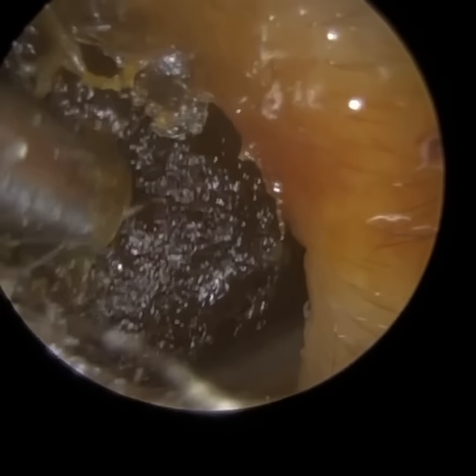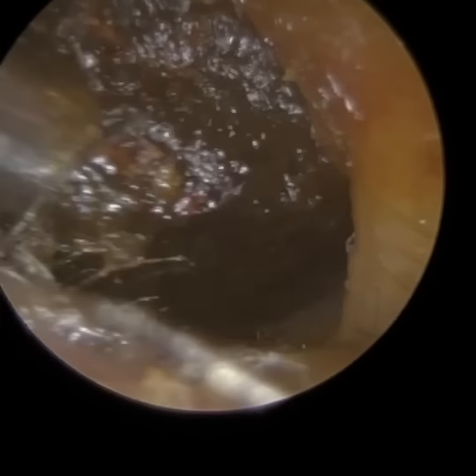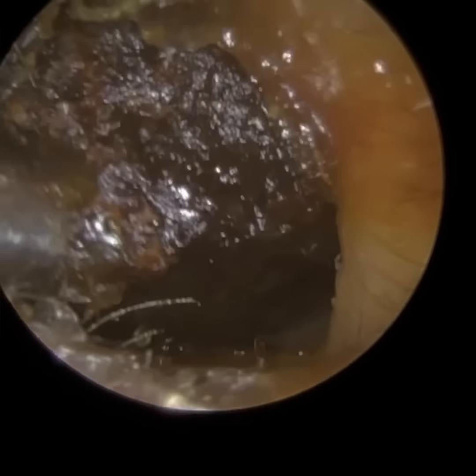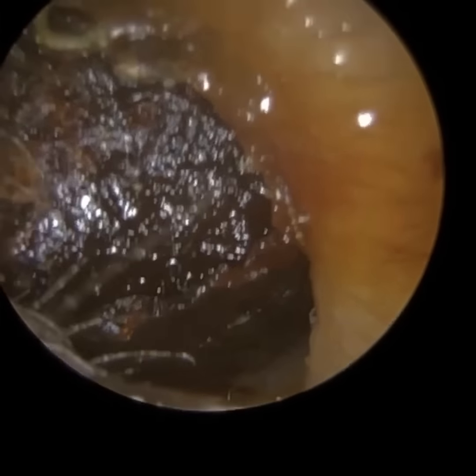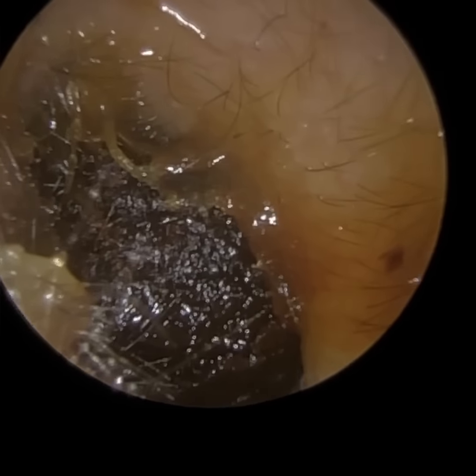The ear canal curvature goes from left and then to right. And this plug — you can see it's trapped. The right-hand side of the plug is touching the second bend, whereas where I am now with the Zolnir Suction Probe, that's coming in contact with the first bend. So what I'm trying to do is swing this around from left to right, so it goes around that second bend and past that first bend.